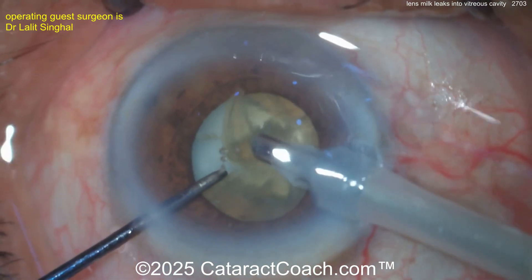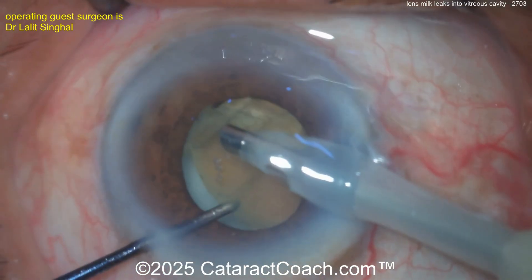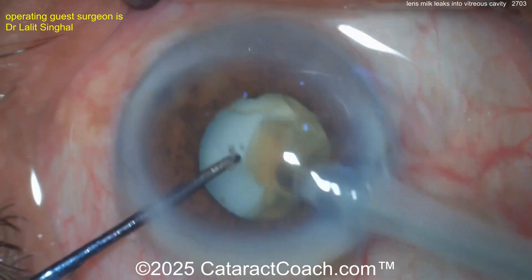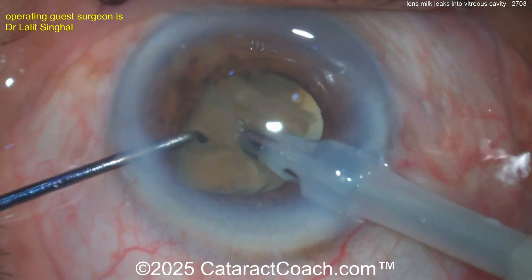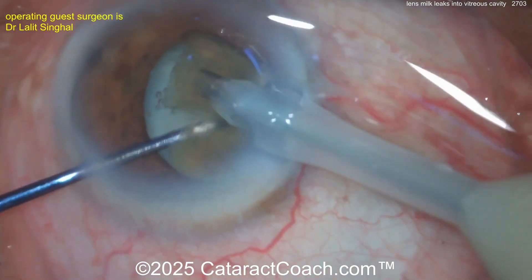The lens nucleus is coming up — that dense lens nucleus is coming out very nicely. But look at the liquefied lens material behind the posterior capsule. Again, I've never seen this, and to be frank, I hope I don't have to see this in person. This is a tough case and I'm not sure what the best next move is.